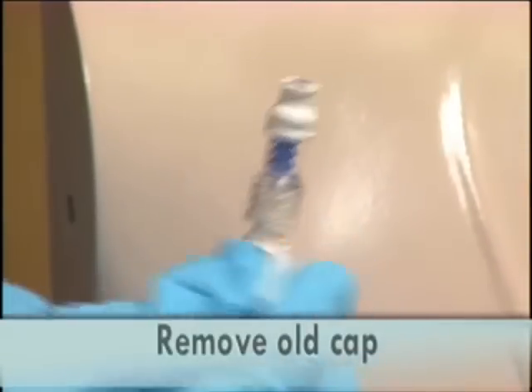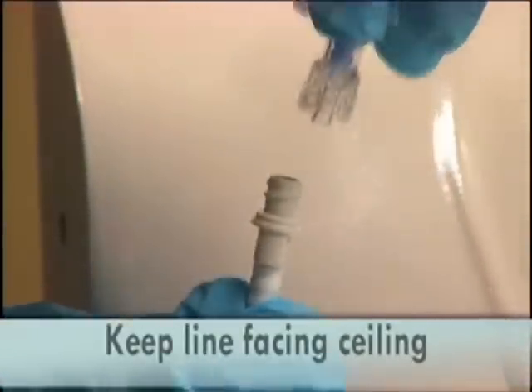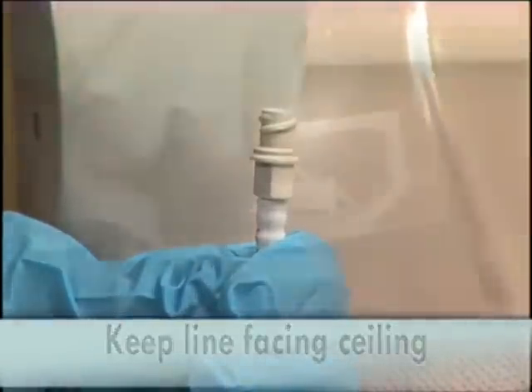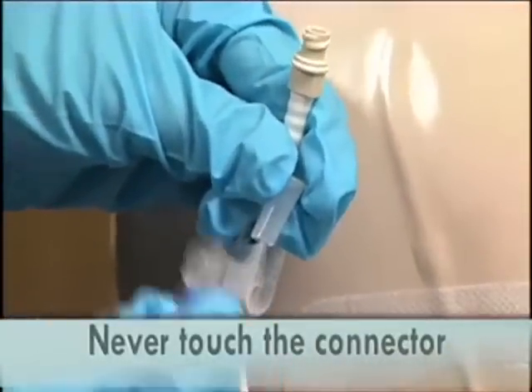Remove the old cap and set aside. Keep the line facing toward the ceiling at all times — this prevents the possibility of contamination. Never touch the connector or the inside of the cap.